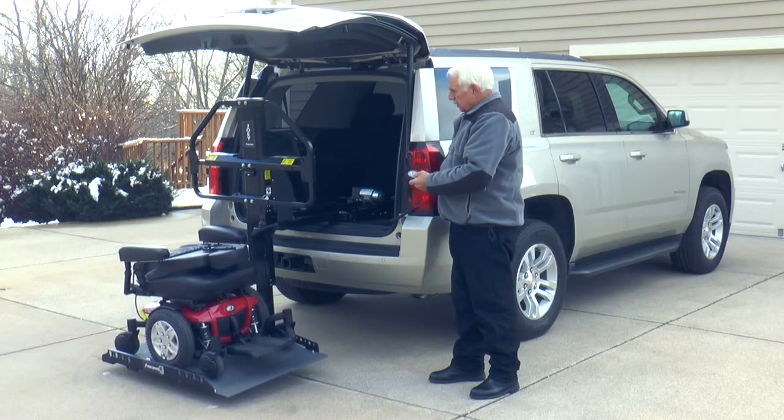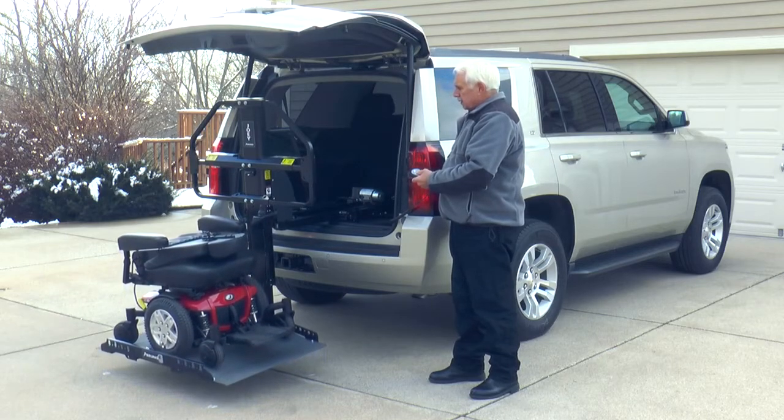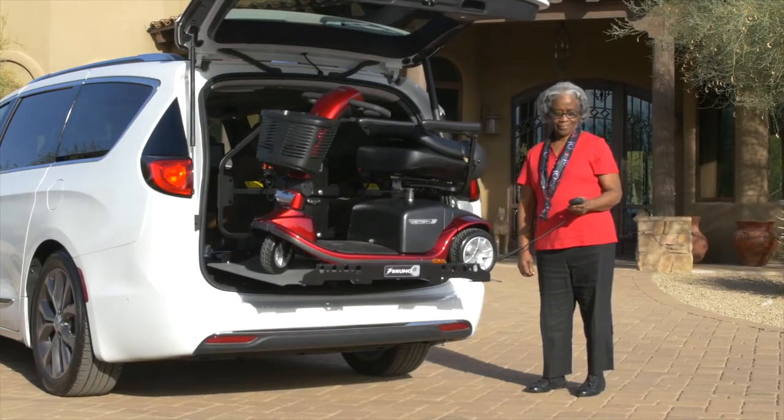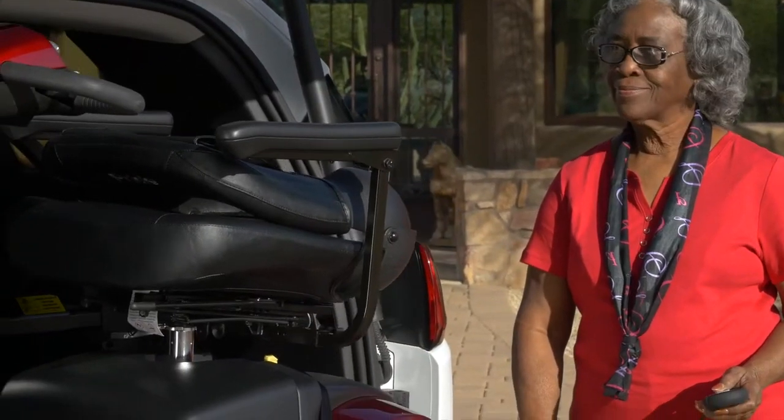Whether you're loading your scooter or power chair during the day or night, in the snow or sun, the Joey is the fastest, safest lift on the market. Bruno's Joey is truly as easy as it gets.